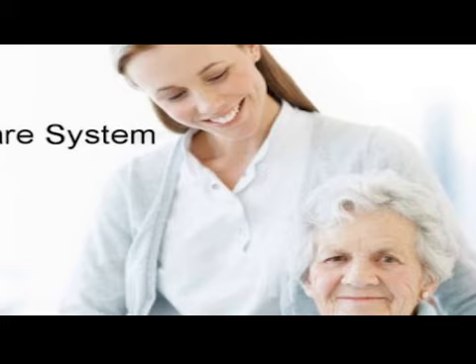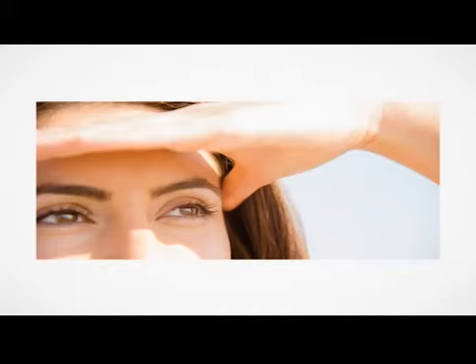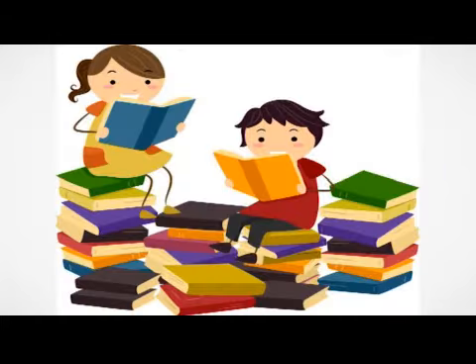Spectacle magnifiers have stronger and high-powered lenses compared to the usual eyeglasses and are designed for close work. The powers range up to plus 24 diopters. Spectacle magnifiers are used for tasks such as long-term reading, writing, needlework, making invoices and receipts. They are usually monocular with the weaker eye blanked out. The person using them needs to hold the reading material very close to their eyes in order to keep the print in focus. One needs some practice to get used to these spectacles.